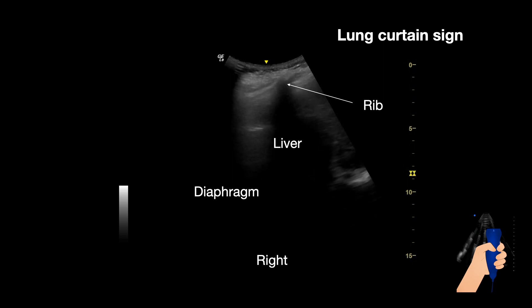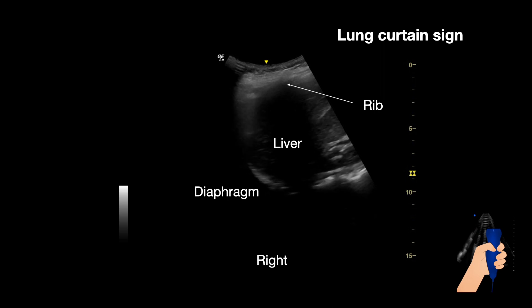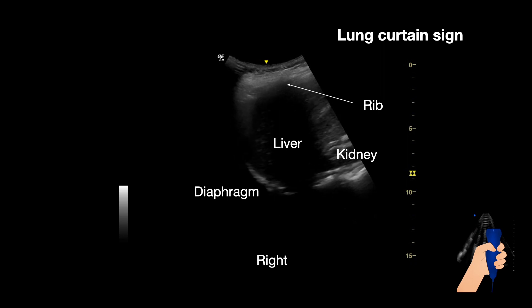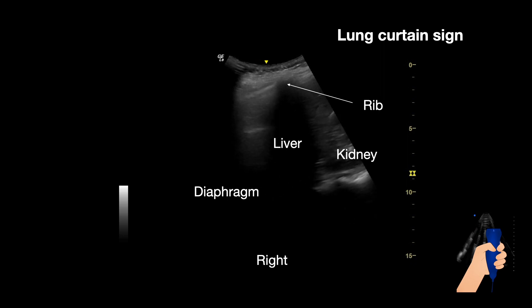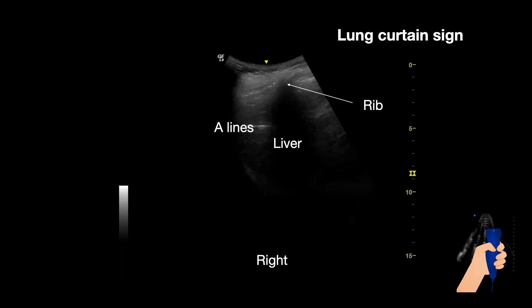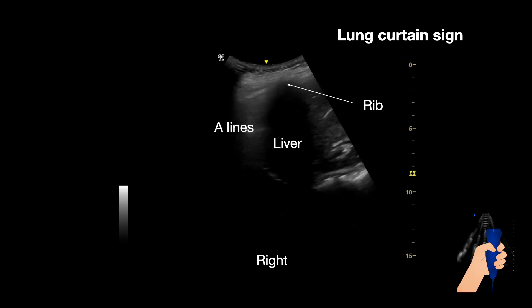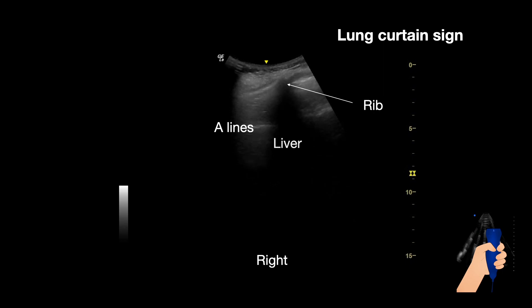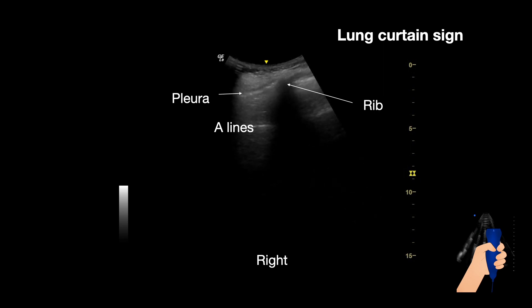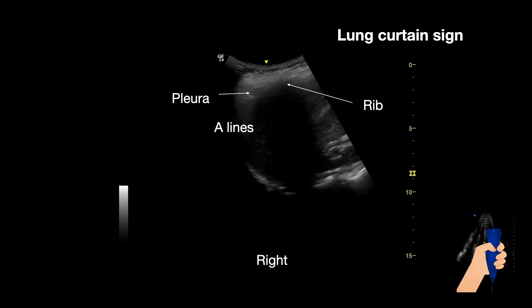The liver is below the diaphragm and is also getting in and out of our visual field. The kidney is getting in and out of our visual field, and this is because of normal breathing. Then we can see A lines, which are produced because of the air of the lung — a normal aerated lung. And lastly, we can see the pleura normally sliding.